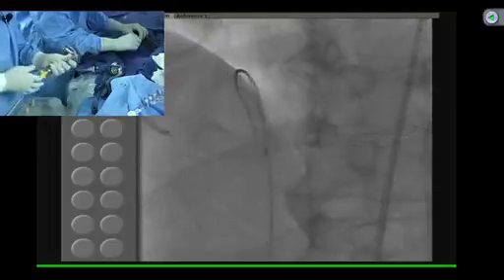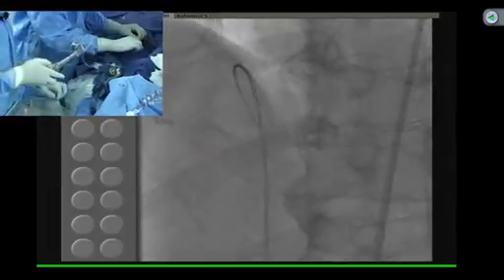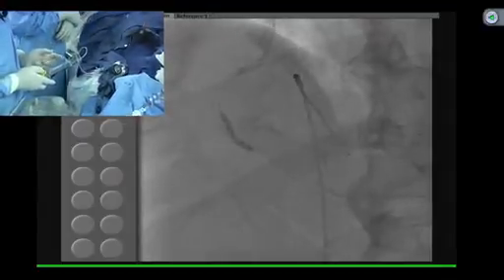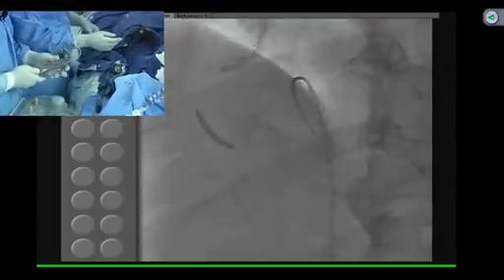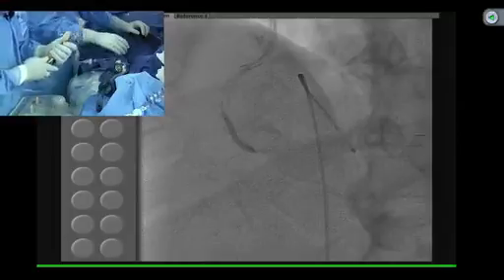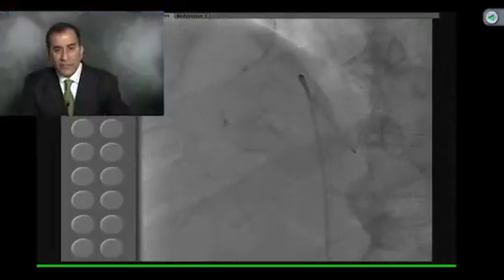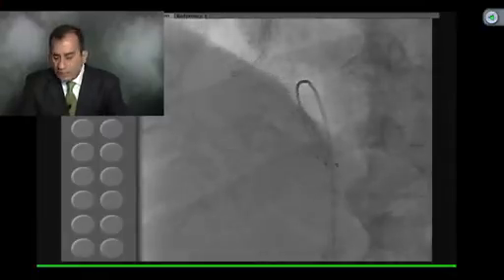Now this is the 20 atmosphere for the mid. See that lesion? It was said to be non-calcific, although it has not expanded despite this small balloon. It's a small balloon, but has not expanded. Anu, at some stage if we can do an angio run to see. Yeah, we are going to do it now.